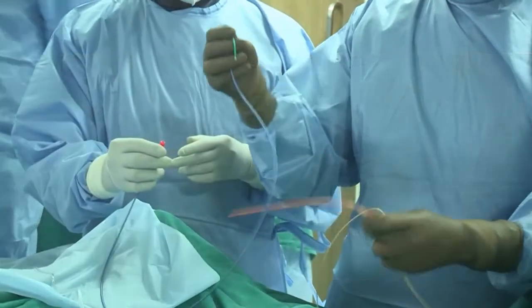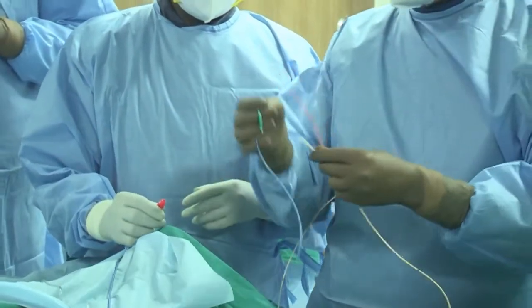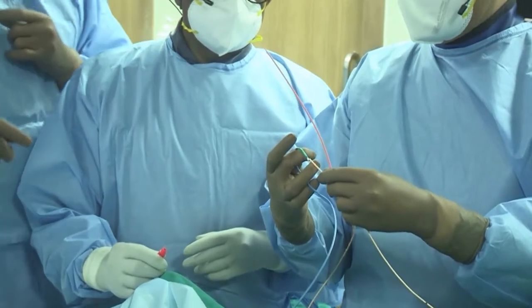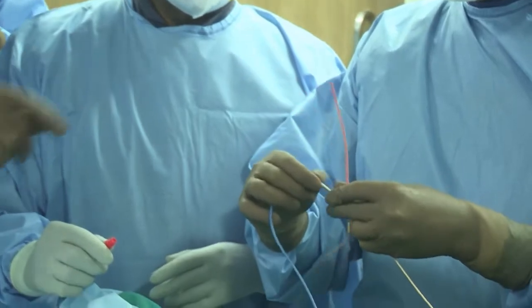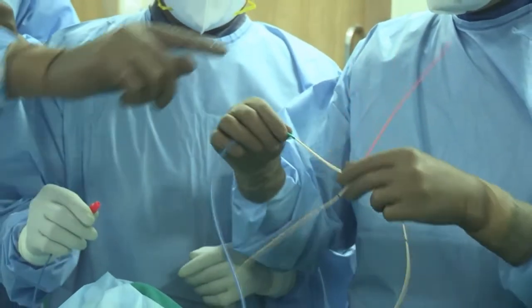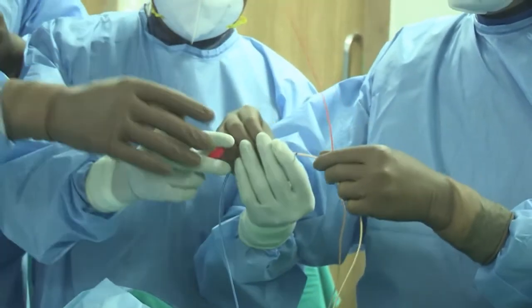And what we are going to do is we have to always load it from the back side. The hydrophilic coating is in the front, and the reason for doing this is that we don't want to disturb this hydrophilic coating, as well as we don't want to damage the tip. So this is how we go back. The tapered end is always on the front, and the blunt end is always behind. So we are going behind.